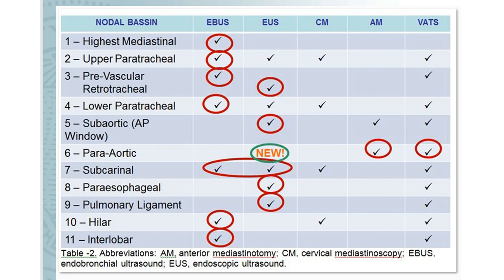A combination of these techniques has a higher negative predictive value compared to either of the tests done alone, which is about 96% with the combination of techniques versus 88% with EBUS alone.